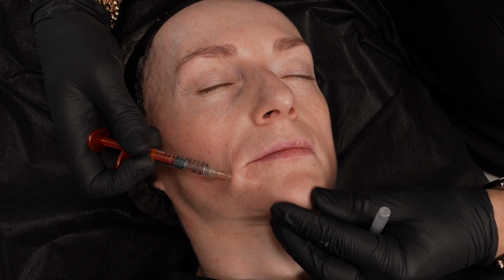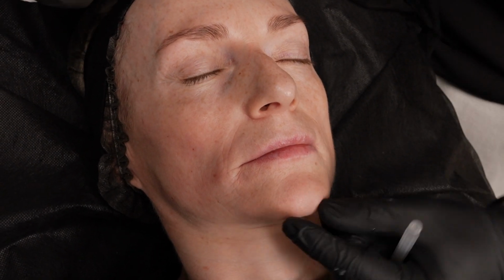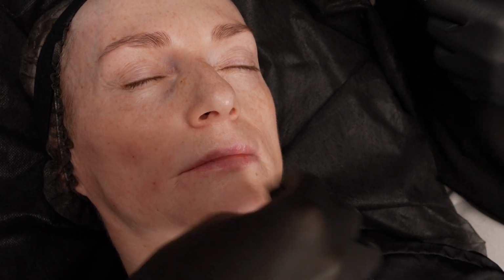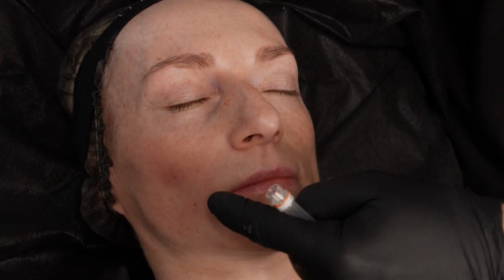Он на мышце, то есть не под мышцей. У нее объем хороший, то есть по всем линиям и проекции достаточно твердый, просто форма. Just make this curve. Just fill here. Такая. Чуть-чуть correct, её как бы собрать. Correct with the needle. No, do it with this. Окей.